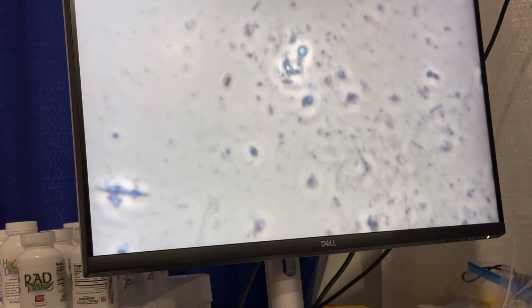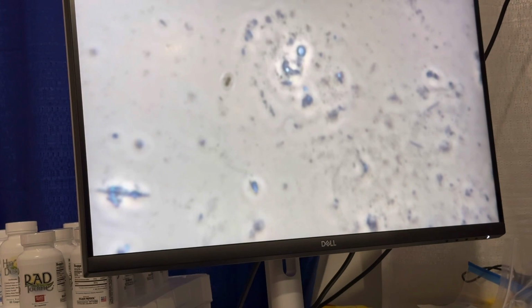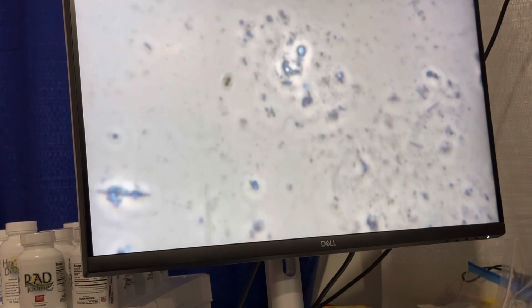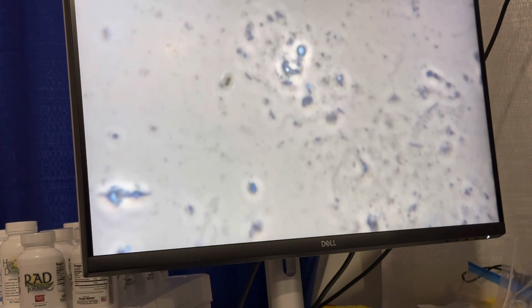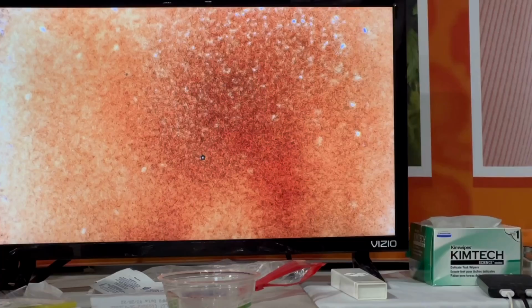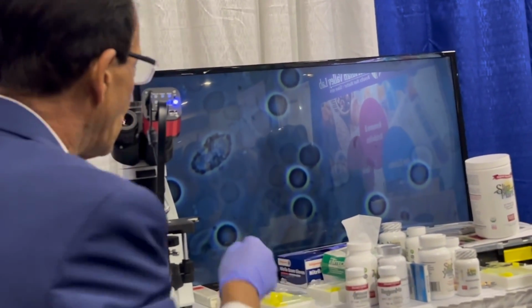Let me show you. Are spirochetes always pathological? Whose mouth is this? A prior person that has known issues. So the spirochete is always pathological in the mouth, or is it common? Is it commensal? Can it be commensal? Can the spirochete be a commensal bacteria that lives normally present? Yes. Overabundance, not good. White patch, oh, Candida. Candida fungal form.